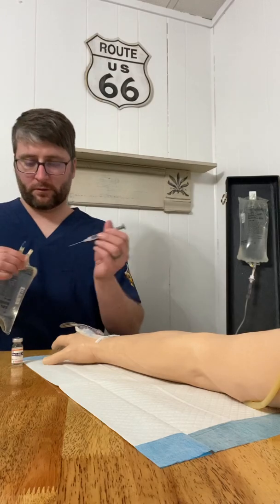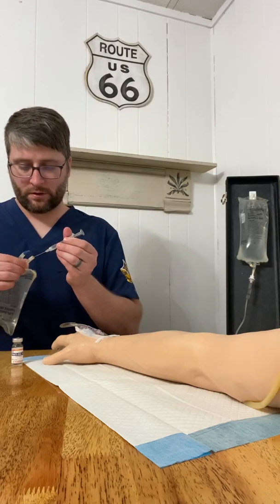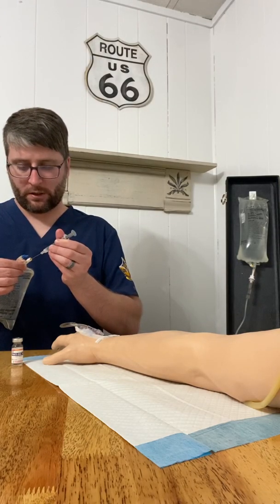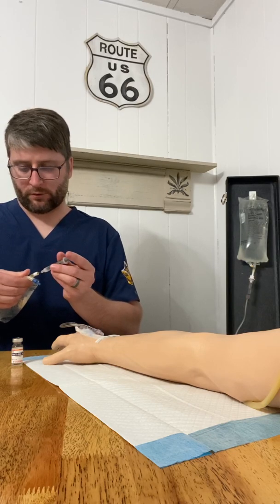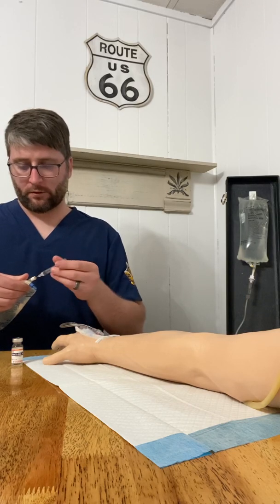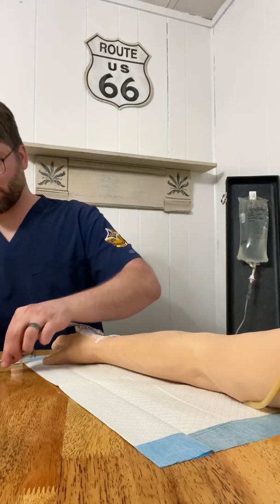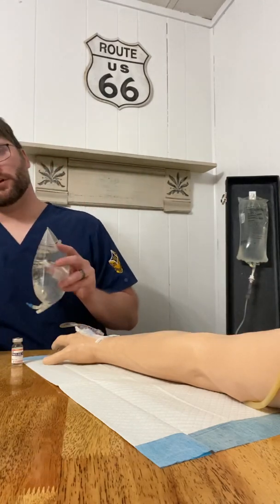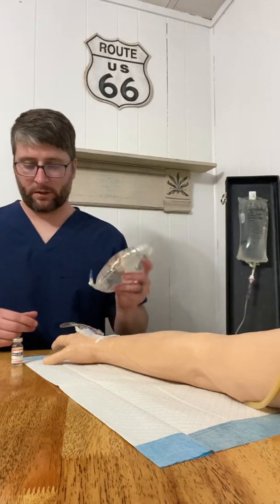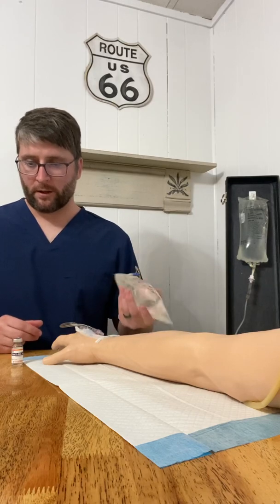We're going to inject that into our port. There we go. We're going to take that out, and then use one-handed scoop. We're going to dispose of that into our sharps container, and then we're going to turn our medication and roll that.